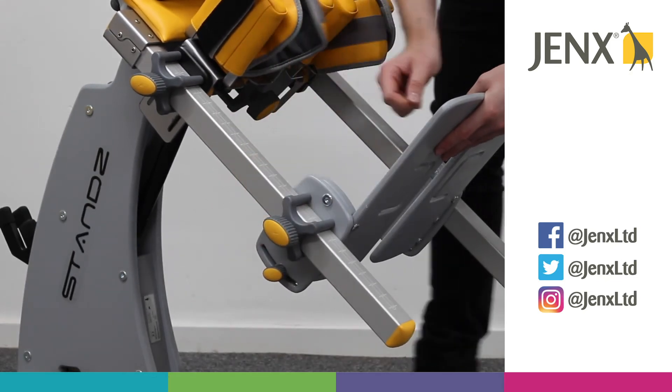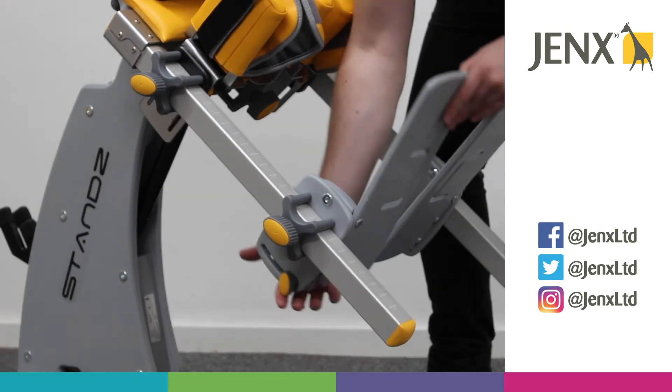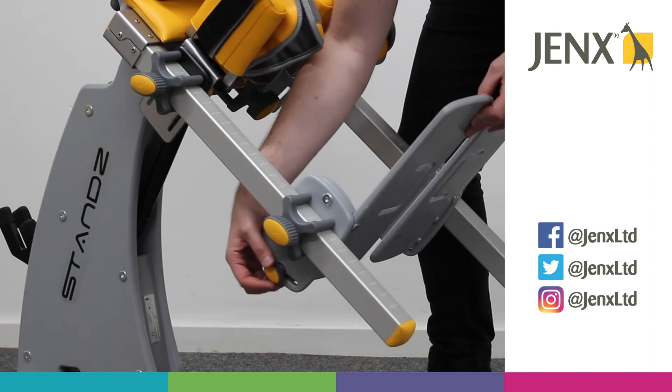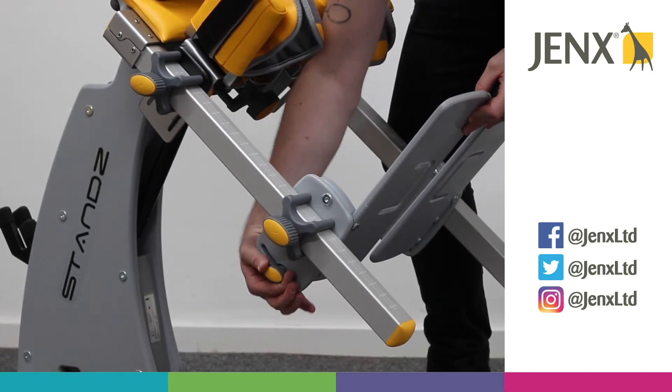We also have the ability to adjust for plantar and dorsiflexion. Once you've found the angle you want, just tighten that up there.